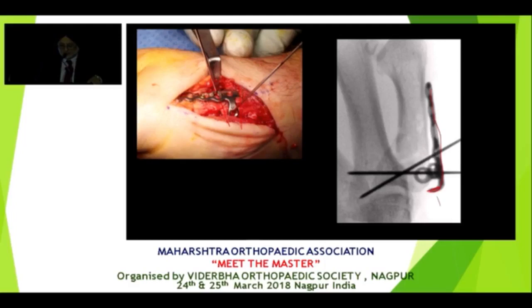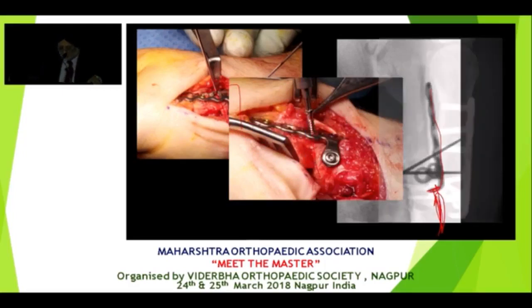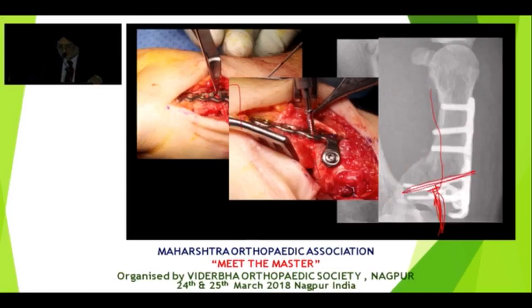Once we've got our fixation, it's very simple. We simply put neutralizing screws there and a lag screw across from here. There's a lag screw right here. So that gives you that added compression.